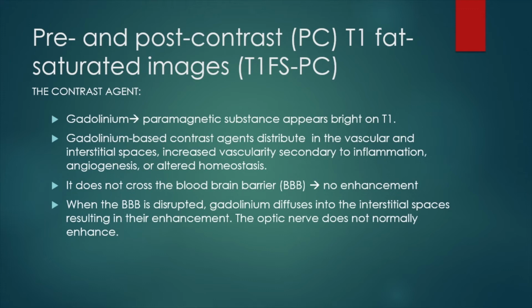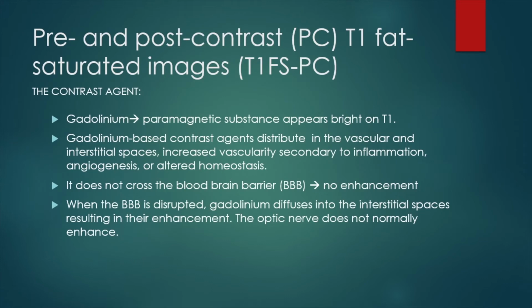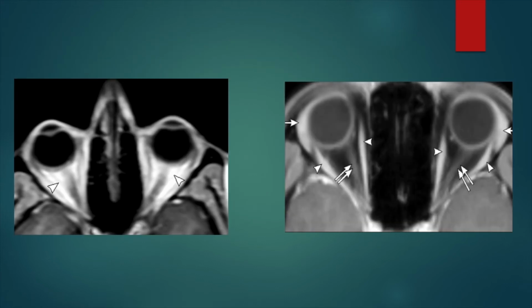This contrast should not be given to renally compromised patients. That would cause nephrogenic systemic fibrosis. And this can be used safely in children above 2 years of age. So this is a T1 fat saturated image. Yes. So this is post contrast.